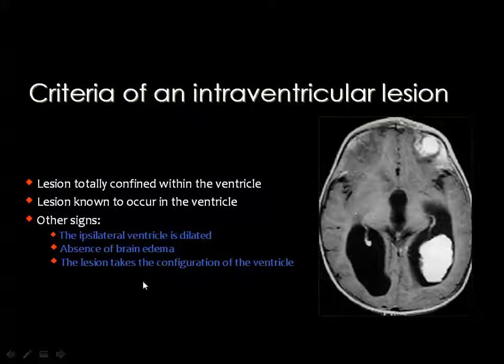Whenever the lesion is enlarged, it will in most cases take the shape or the configuration of the ventricle itself.